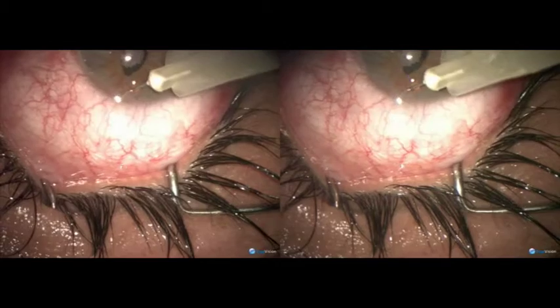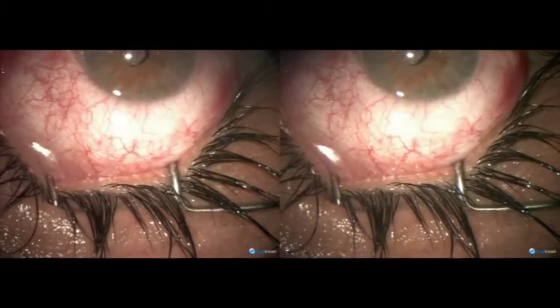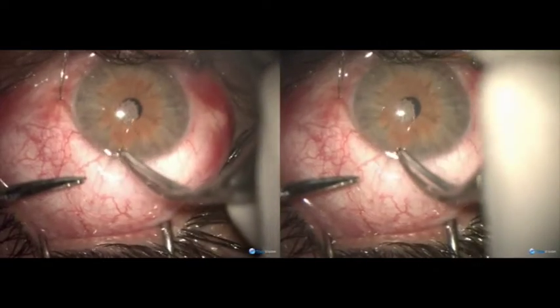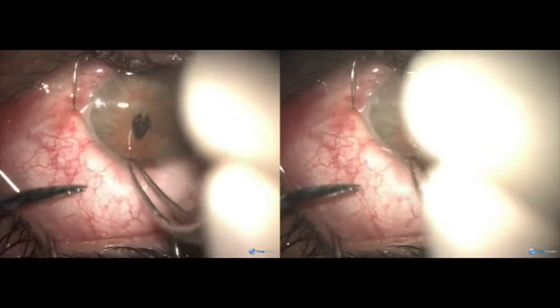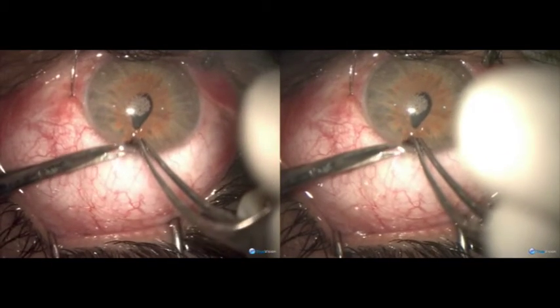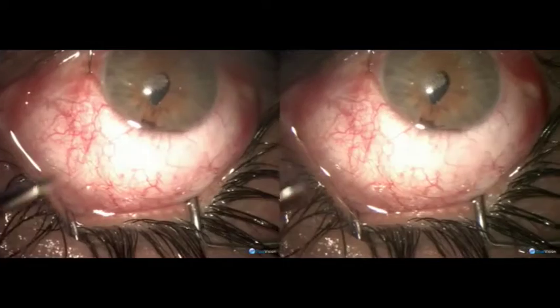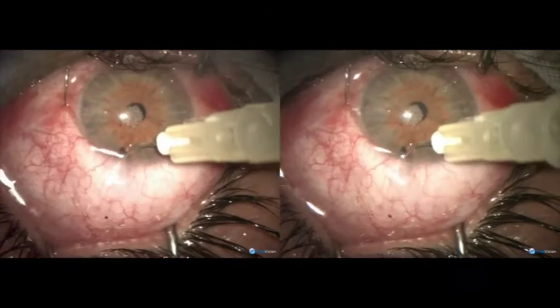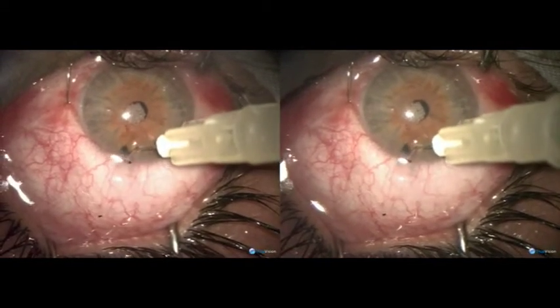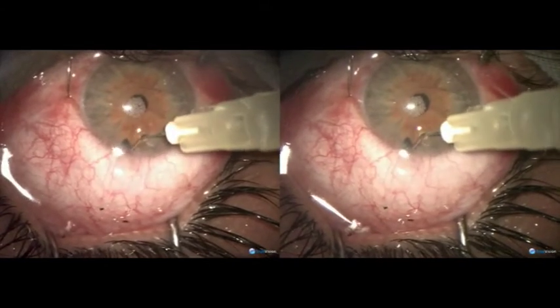The 1.5 millimeter opening is good enough to perform iridectomy with a fine forceps. After constricting the pupil, we catch hold of the periphery of the iris, pull it towards the center, and perform iridectomy. A beautiful triangular peripheral iridectomy is obtained.